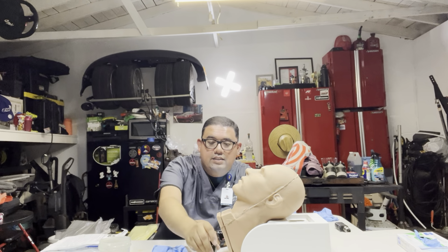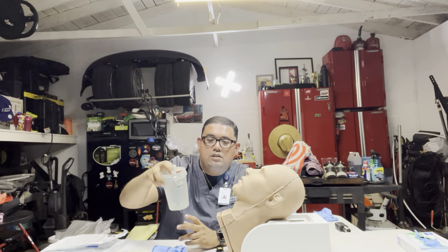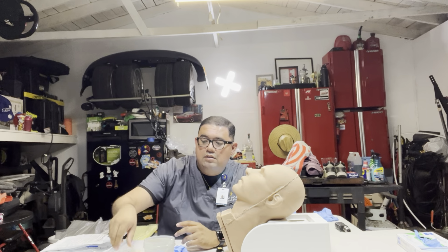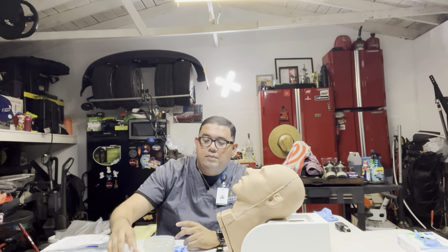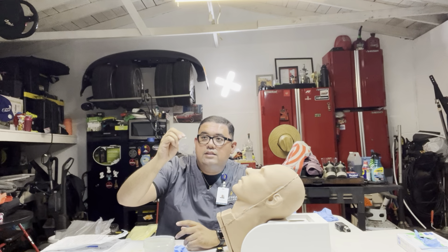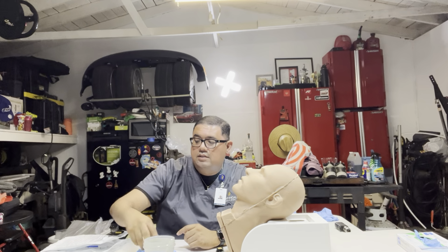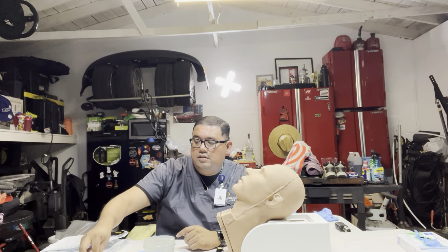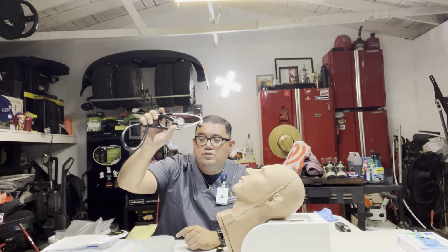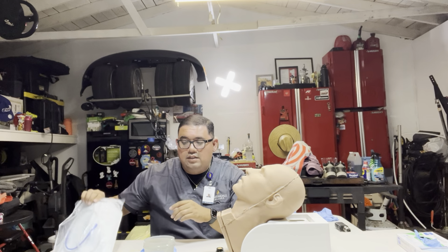I have a flashlight, an emesis basin, a cup with water and a straw, some tissue, a piston syringe, a towel, my pH paper, my specimen cup, my safety pin needle, my lubricating jelly, my gloves, a Sharpie, two types of tape, plastic and paper, along with my stethoscope to check placement, and the nasogastric tube itself.